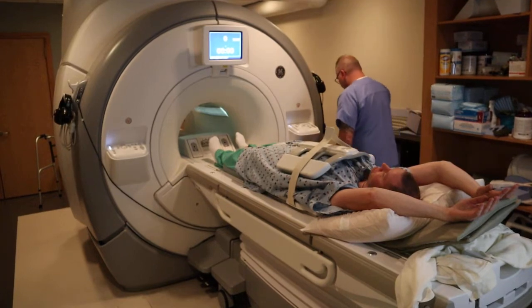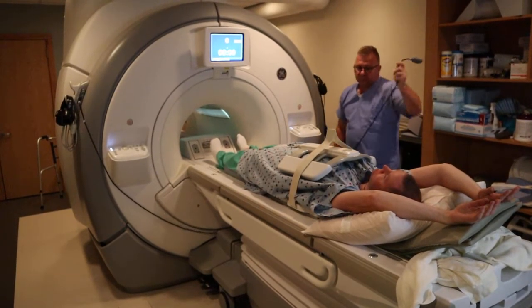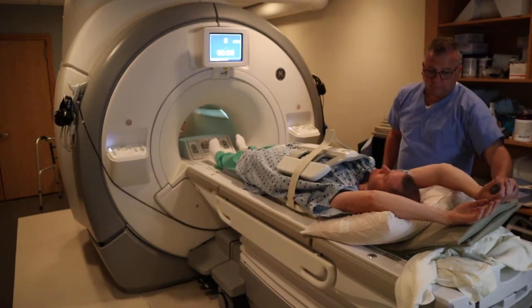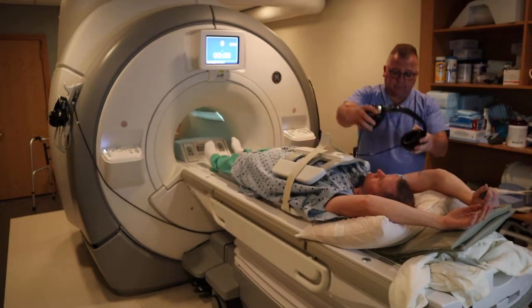You're going to fasten the coil. You're going to provide an emergency ball to communicate with the technologist, and a headset to listen for instructions.